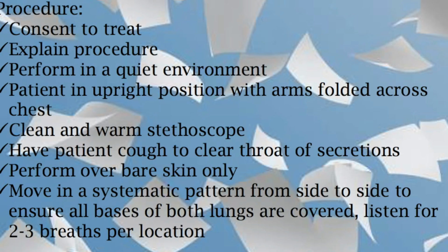First, after asking consent to treat the patient, the therapist explains what the procedure will be. If the patient is able, the therapist puts them in an upright position with arms folded across their chest. The therapist cleans and warms the stethoscope.